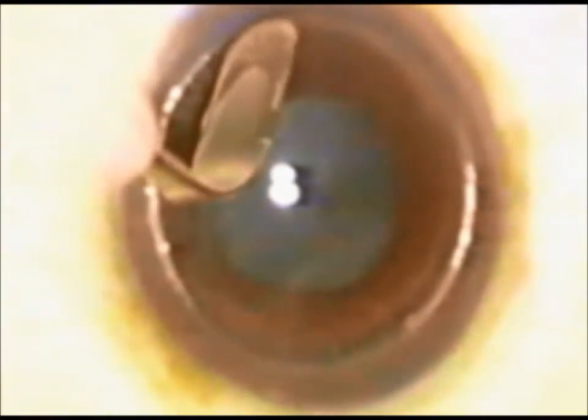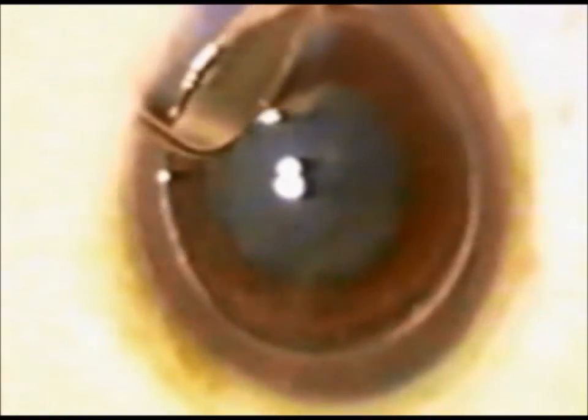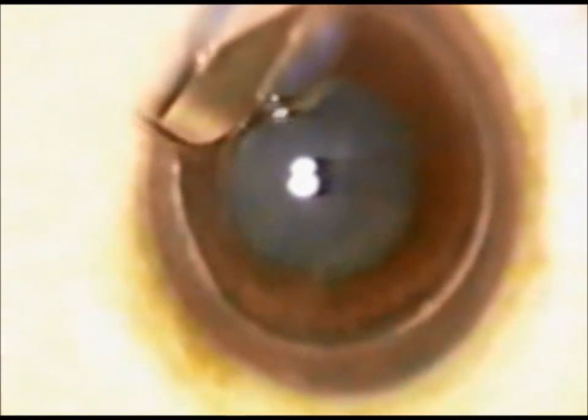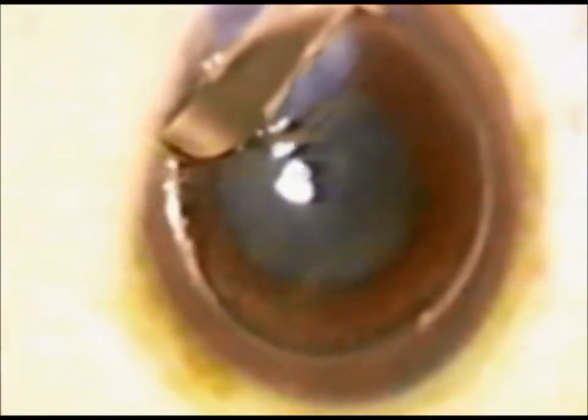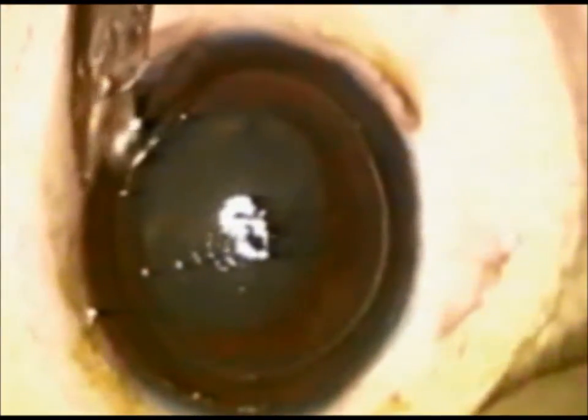We use this groove to dissect the cornea with the help of a crescent blade in a lamellar fashion, two millimeters peripherally all around. The superficial strip of peripheral cornea of approximately 300 microns is excised, and subsequently the full-thickness corneal button is cut.